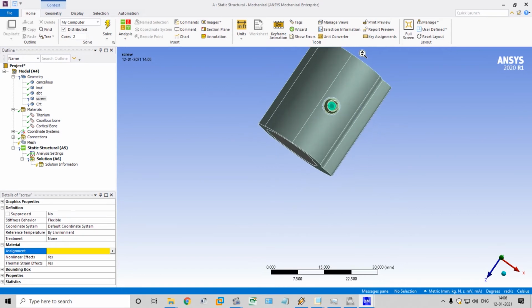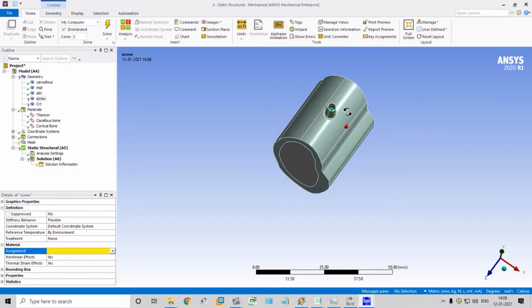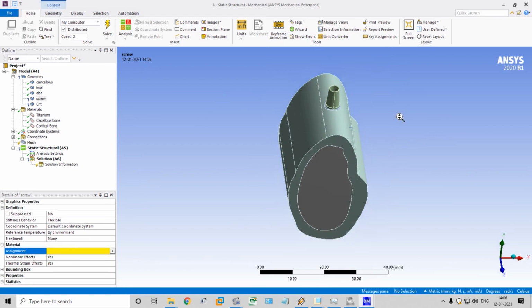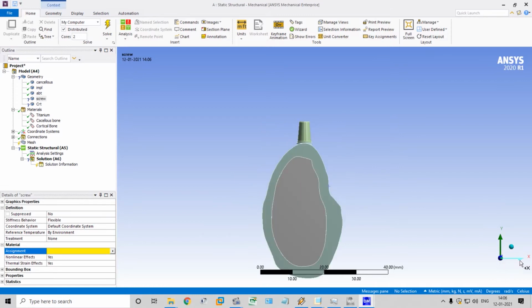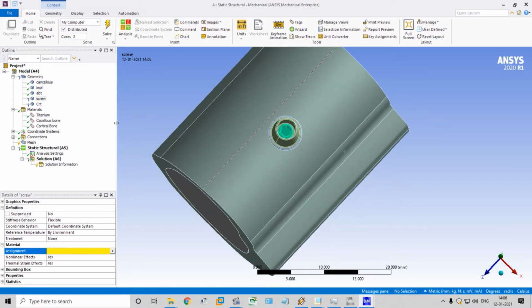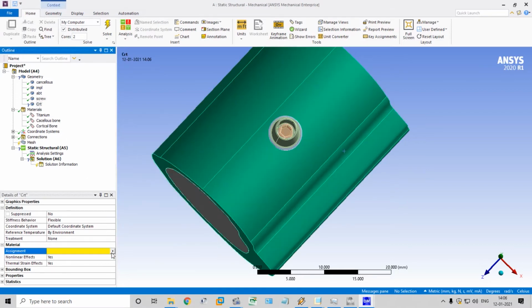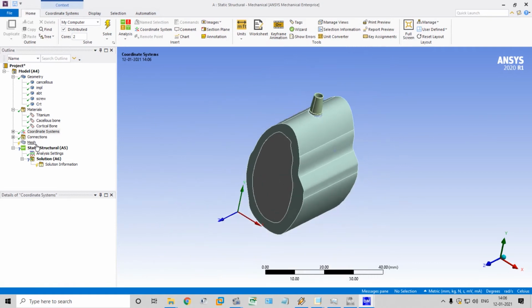When I rotate the mouse ball forward, it will zoom in. Backward means it will zoom out. Rotate with middle click and move the mouse means it will be rotated. Okay, here viewpoints, Z, x-axis. Fully the default orientation. Screw is selected, highlighted here. Then click titanium, cortical bone. Okay, that's all. Coordinate system will be assigned by the software itself.